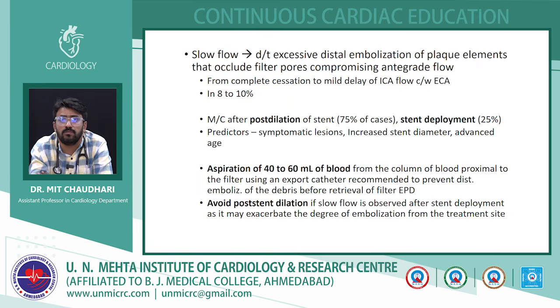This can be because of distal embolization. If such embolization occurs, then one should consider aspirating up to 40 to 60 ml of the blood column proximal to the filter, using a thrombectomy aspiration device, and one can also avoid post dilatation if the result is adequate.